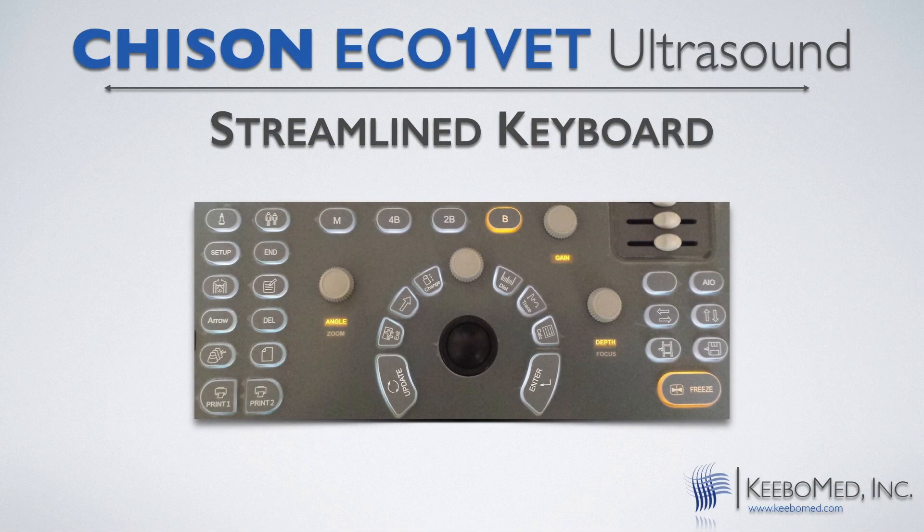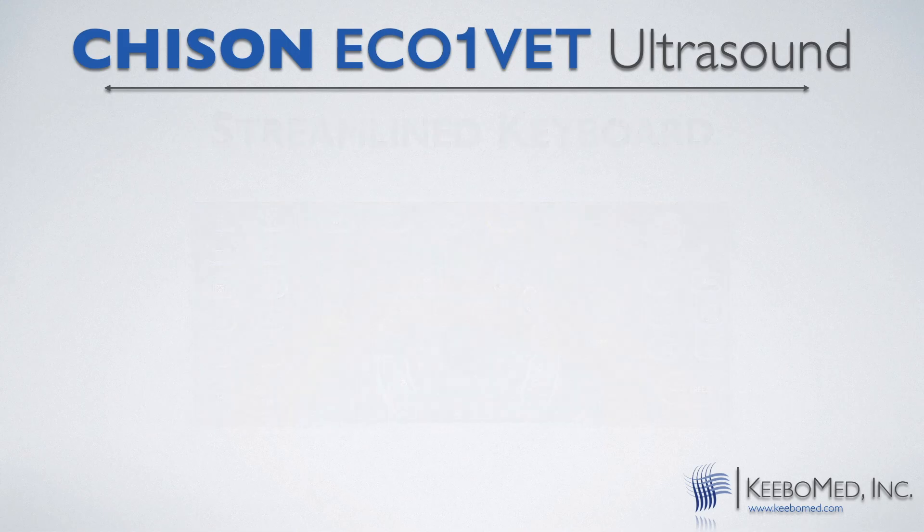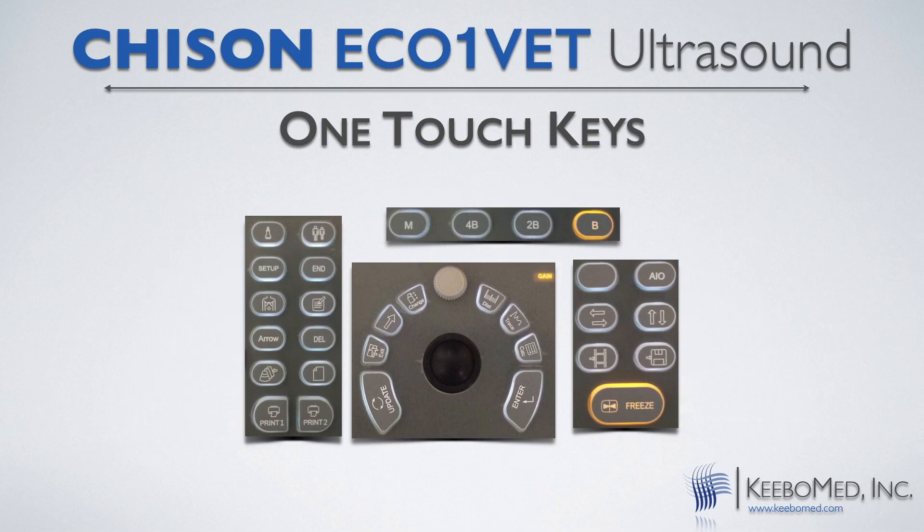The Eco One Vette also offers one touch keys for printing, for saving images, and many other things, saving a lot of time.